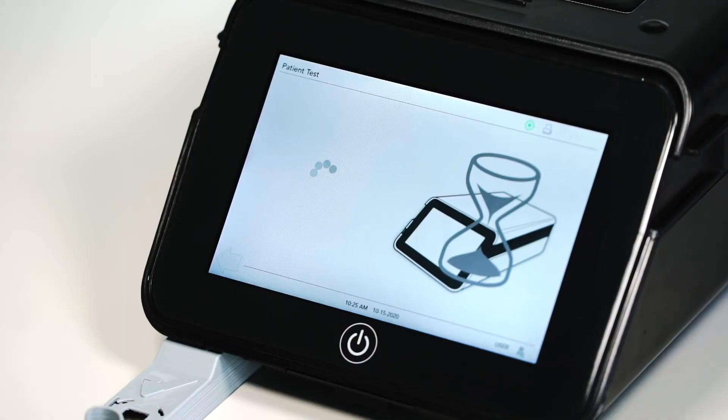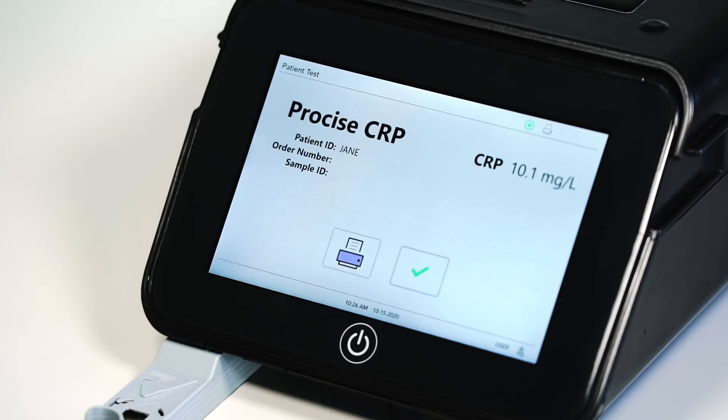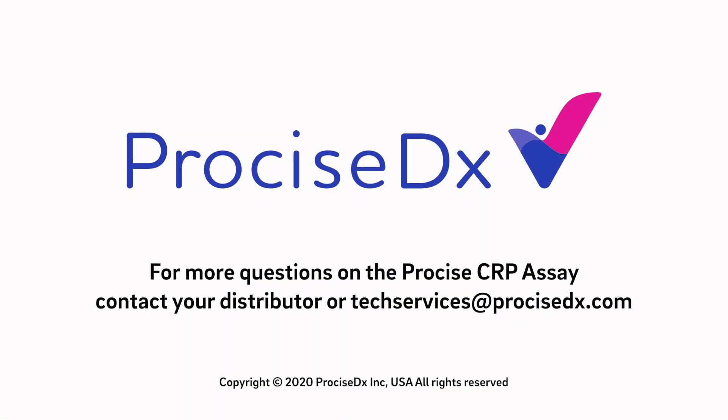Once the instrument is closed, a self-check will occur and the result will be provided. To run additional samples, repeat the workflow from the beginning of this video. For additional support and questions on the Procise CRP assay, contact your distributor or techservices@procisedx.com.